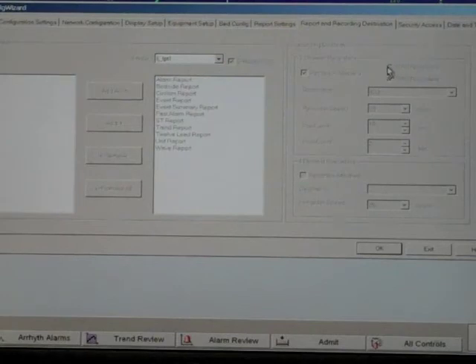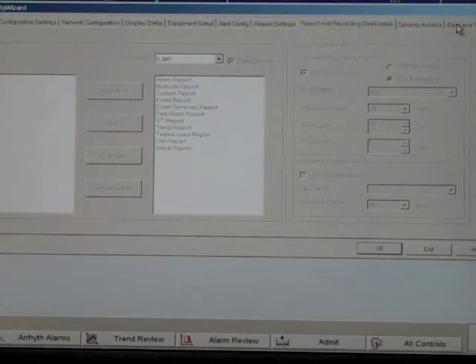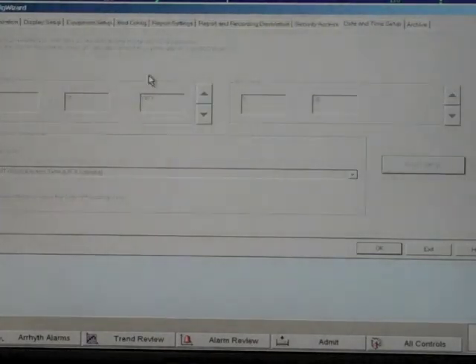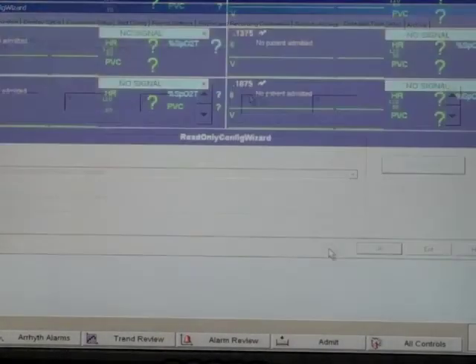Finally, click the date and time setup tab and confirm the system is set to your local date and time.